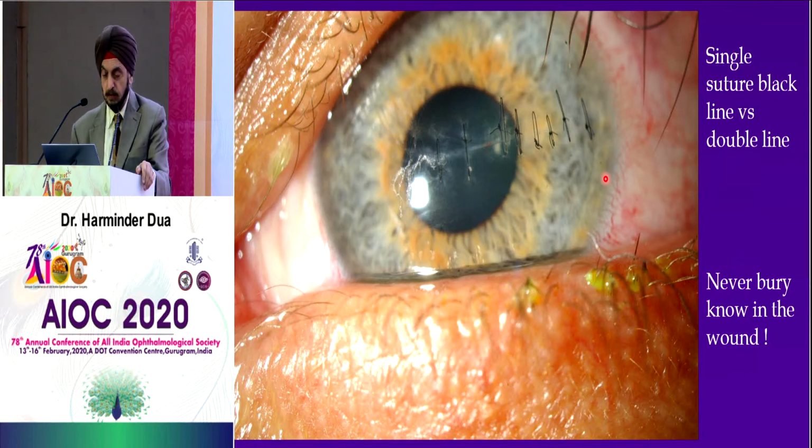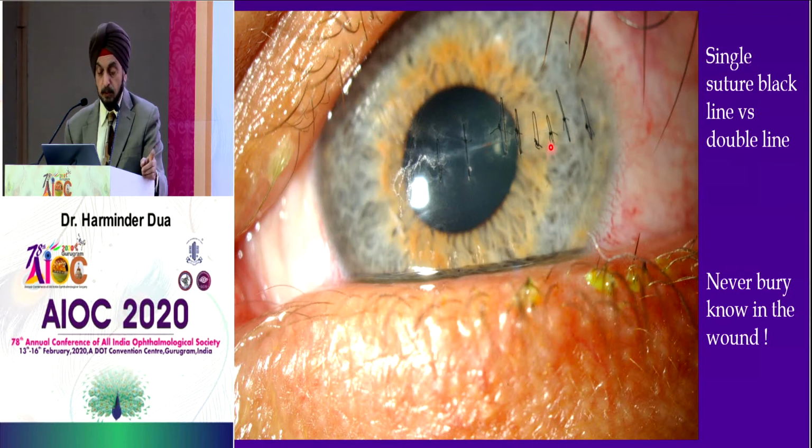This was one of my medical retina colleagues who was on call, and he did things. So you can see the direction of the sutures, not all are perpendicular to the wound, the size is different, the distance between them is different, and quite importantly, some of the knots are actually buried in the wound.